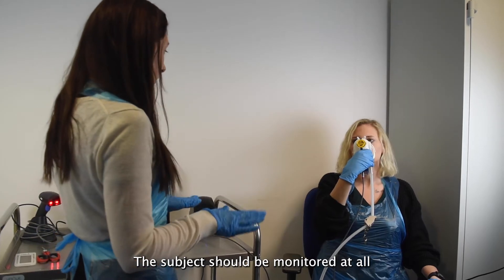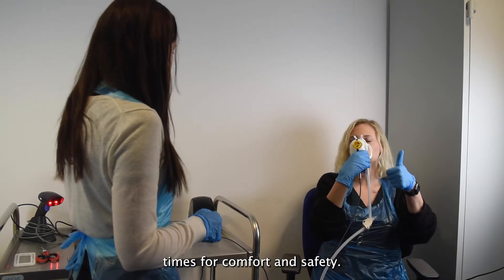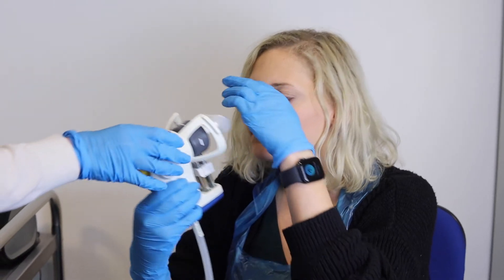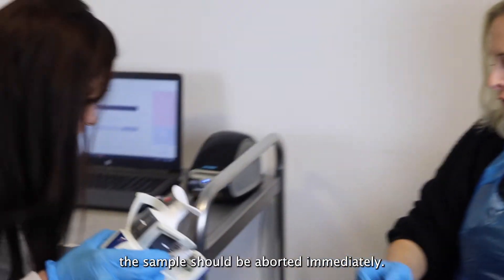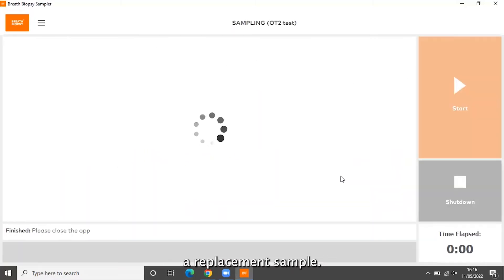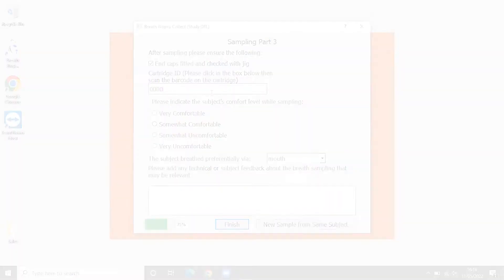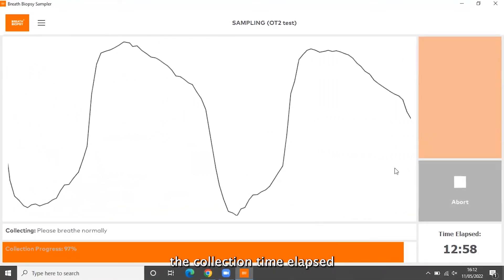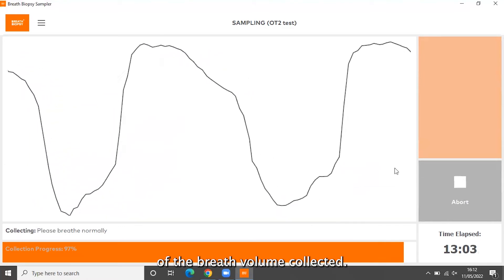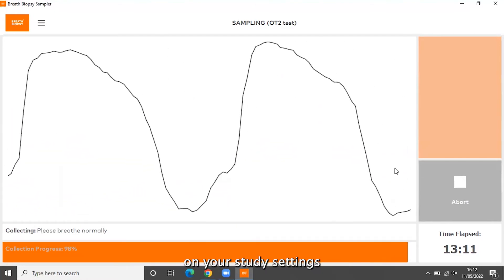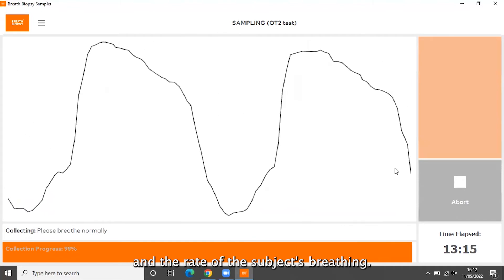The subject should be monitored at all times for comfort and safety. If the subject wishes to stop the procedure, the sample should be aborted immediately. If they are willing to provide a replacement sample, a new breath biopsy kit should be used. During the breath collection, the software displays the collection time elapsed and the percentage of the breath volume collected. Collection time may vary and is dependent on your study settings and the rate of the subject's breathing.